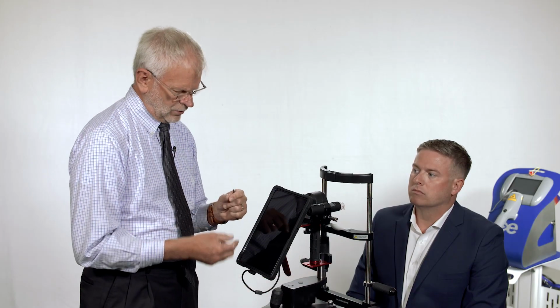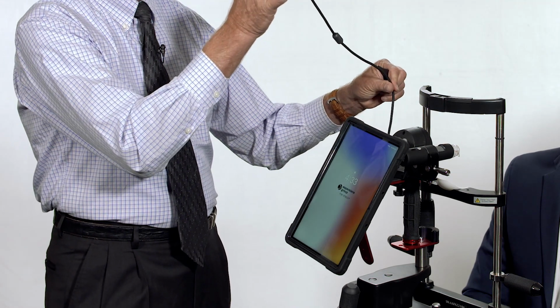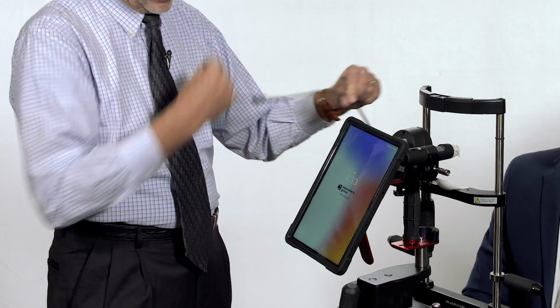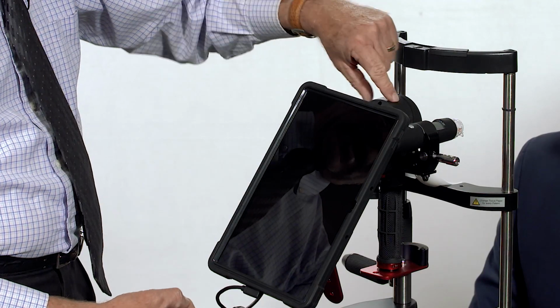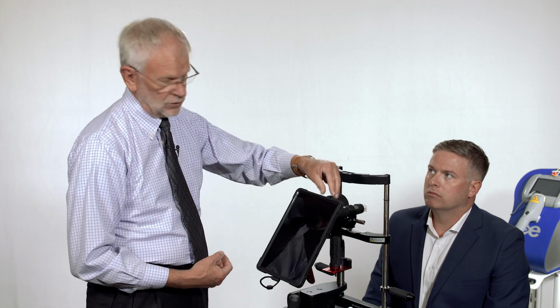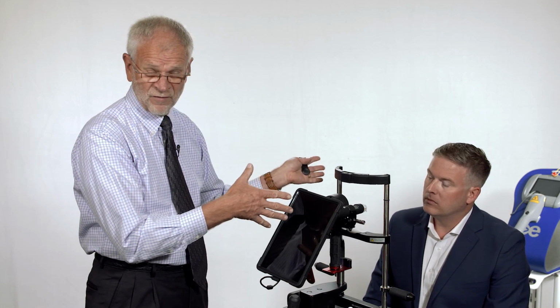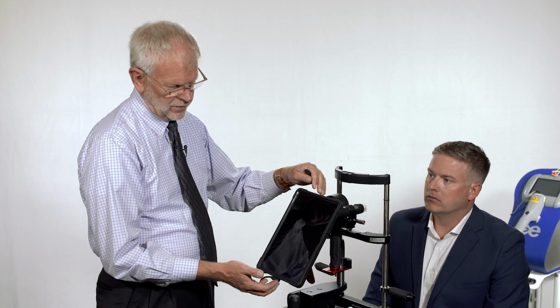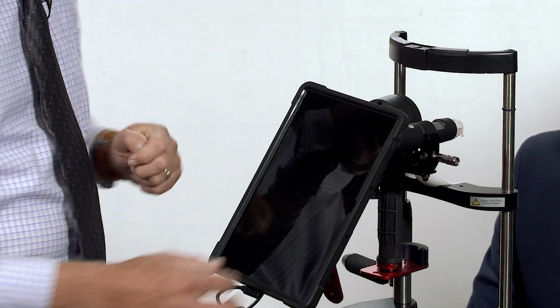The second thing that we found is that when you attach the tablet to the camera, so the camera is positioned in front of the patient, and then there's a cord that goes into the bottom of the tablet, the cord powers the camera. If the camera is on and the tablet is on and you're working during the day, it's drawing a small amount of amperage. And so if you don't turn the tablet off at night, or you don't recharge the tablet on a continuous basis, you could end up in front of a patient and the tablet is basically out of juice. So most certainly, if you're not using the MeCheck for long periods of time, turn it off on the top. That way you're not running the battery out.